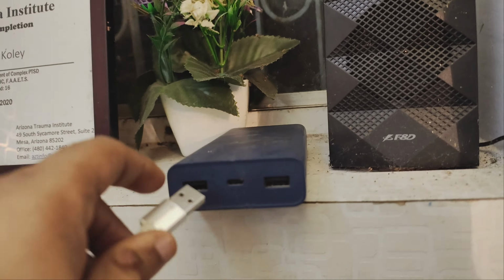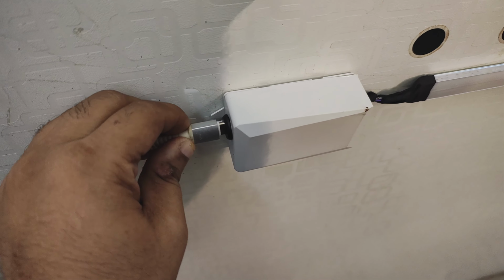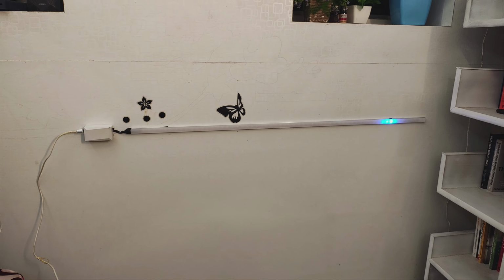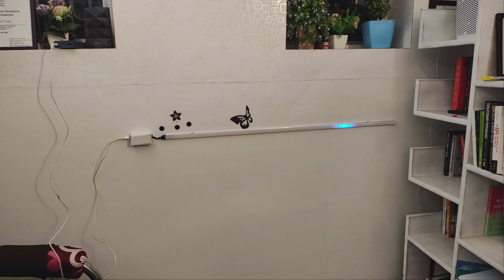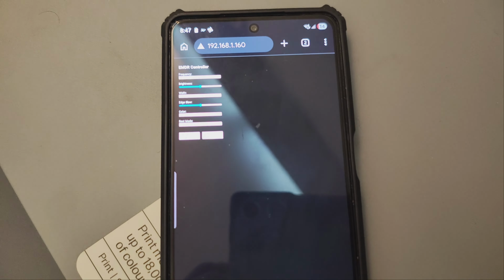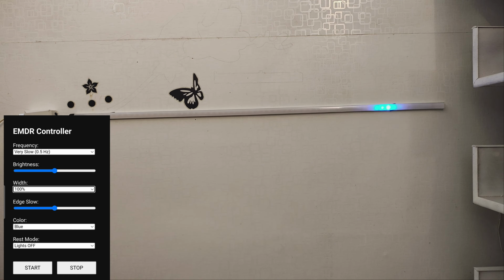Our EMDR device can be powered by a USB power bank for many sessions, or it can be powered by a USB charger adapter. Our EMDR device has turned on and it is now working in the default mode. Now I will take my phone and type in the IP address. This is the IP address I have set in the programming, and this is the interface that we get.